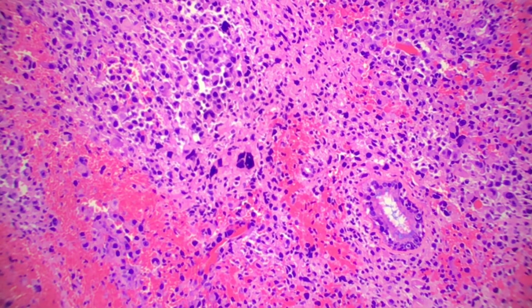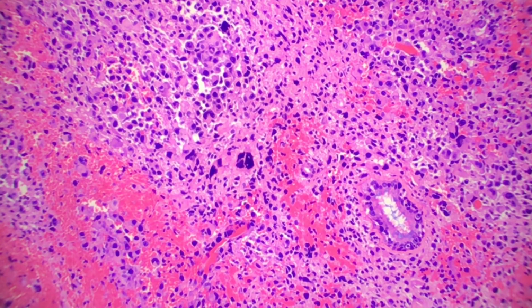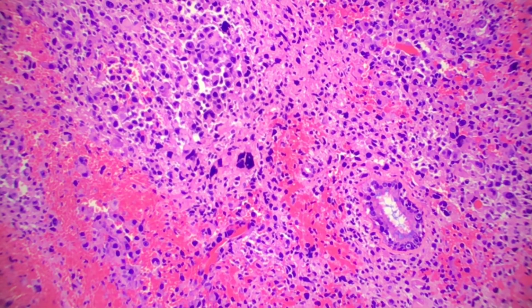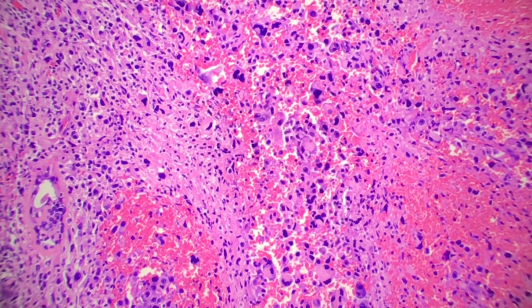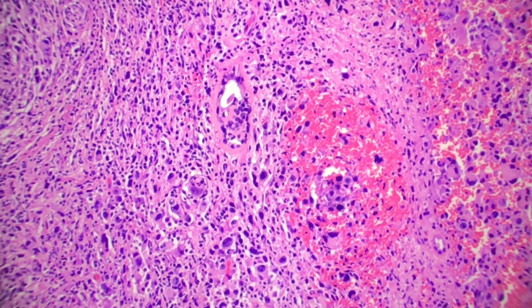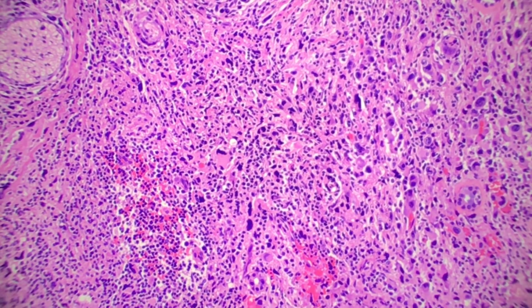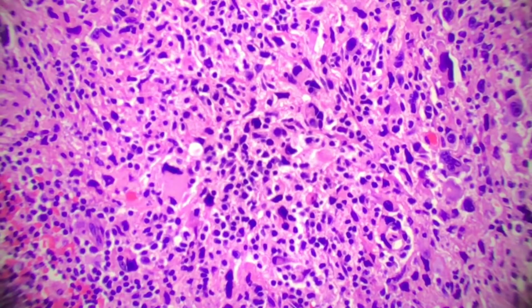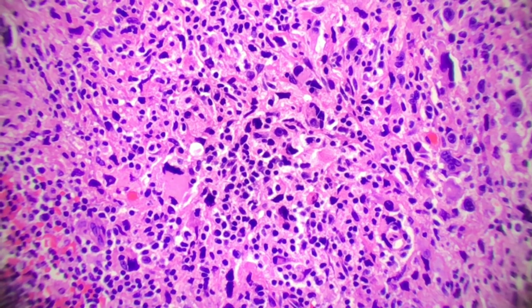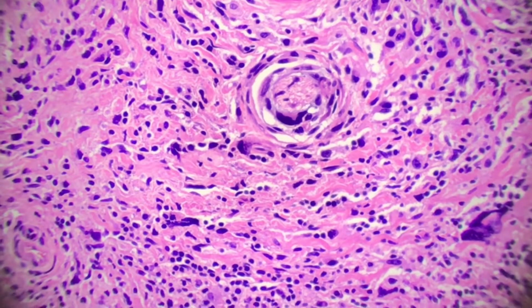Look at that giant tumor cell. Okay, even if you had never seen a giant tumor cell ever, that cell definitely does not fit. It's way too much compared to all its buddies around it. And the giant cells you're going to see in almost every single case. So as I just kind of drive around a little bit on a higher power, and by higher power, we're at 10x, so we're not really high power, but more than the 4x. You can see that in these areas, as I drive around a little bit, we're starting to get a little more of the fusiform.